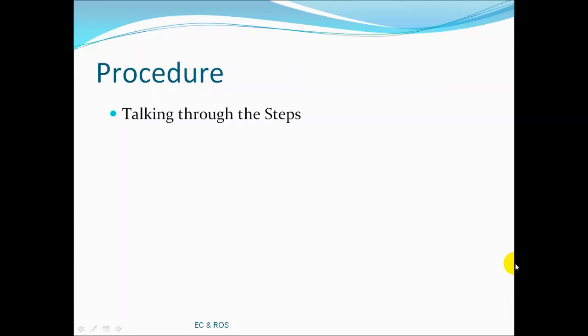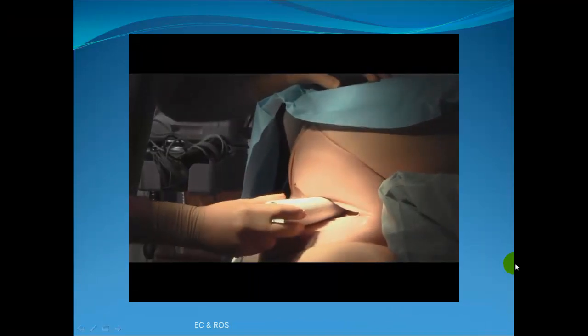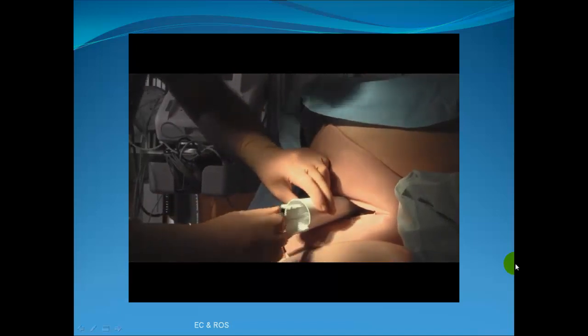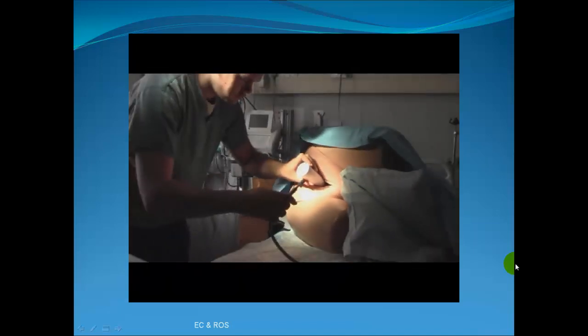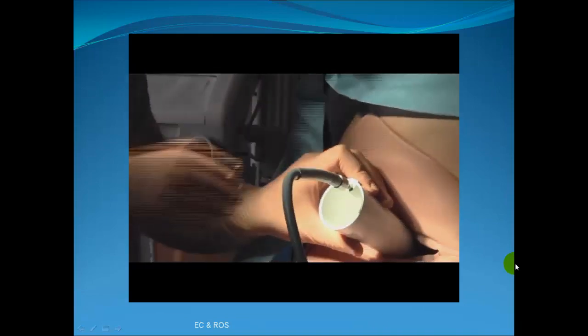The procedure, talking through the steps. Once again, check cervical dilatation and fetal head position. Insert the amnioscope posteriorly along the long axis of the vagina into the posterior fornix. Gently maneuver anteriorly to rest on the fetal head. Remove the obturator, attach the light source, and visually confirm position. Clean and dry the fetal scalp.